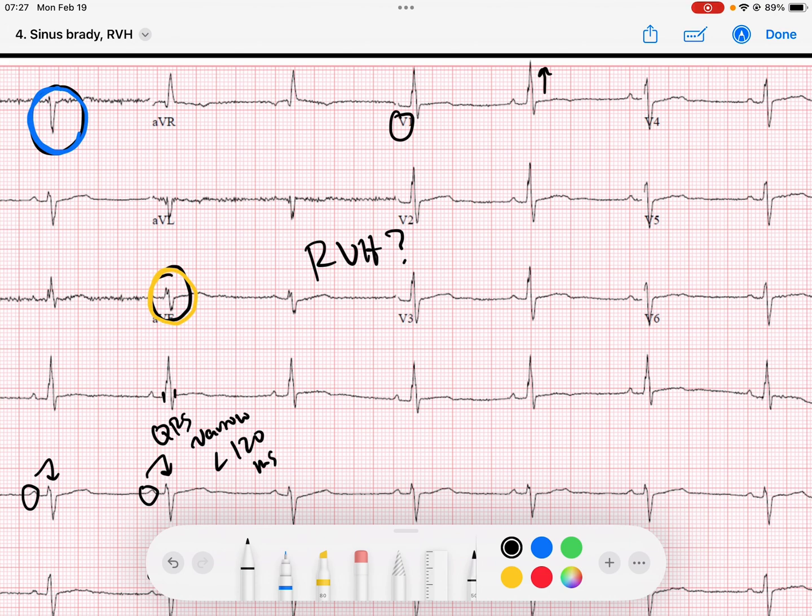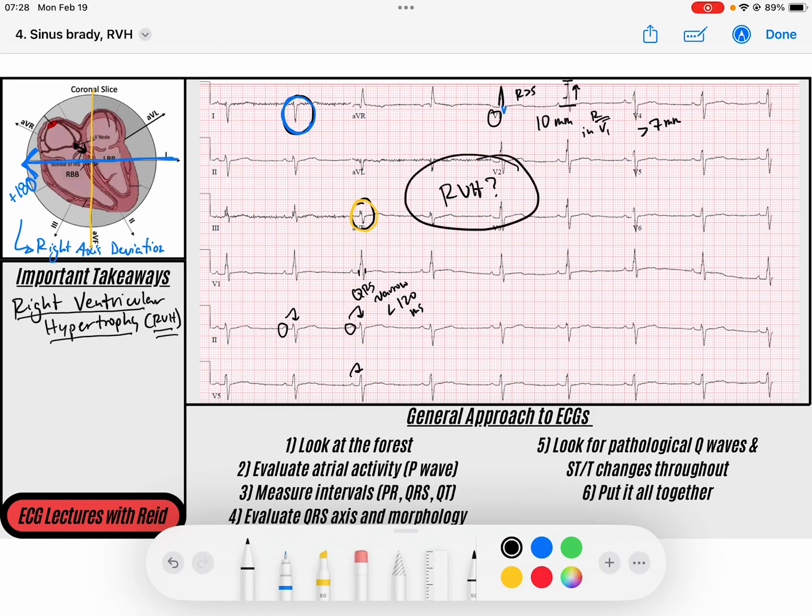I measure the R wave from the baseline to the apex, and you can see that would be well over 7 millimeters. We've got probably 10 millimeters of our R wave in V1. Our R wave is definitely larger than the S wave. The R is definitely greater than the S in V1. Because that R wave is greater than 7 millimeters in V1, that confirms our diagnosis of right ventricular hypertrophy.